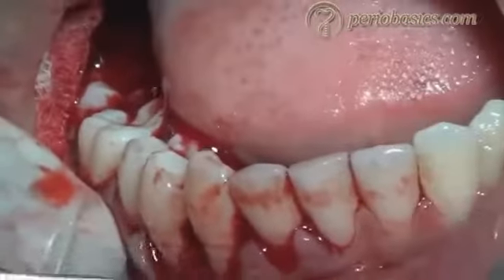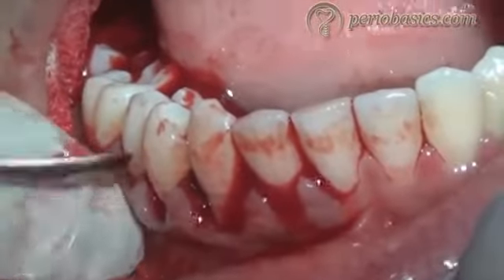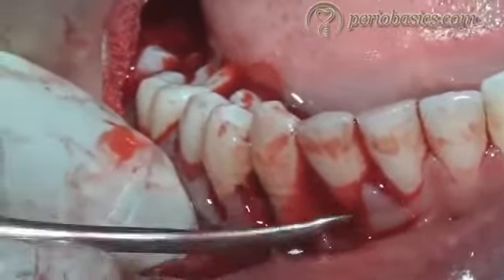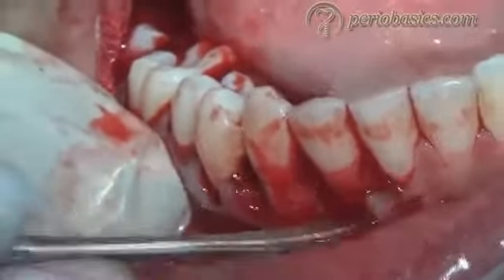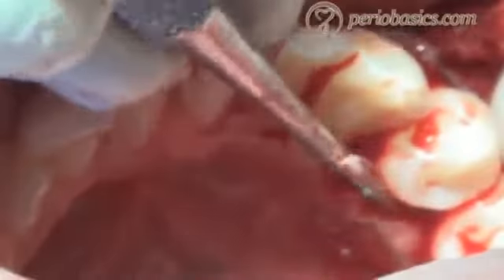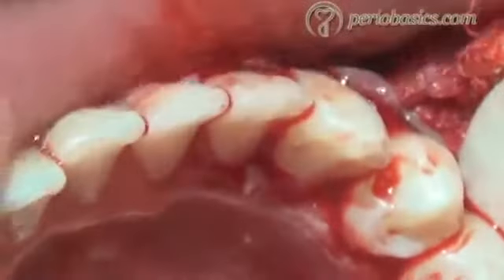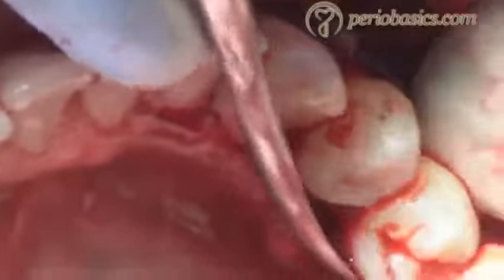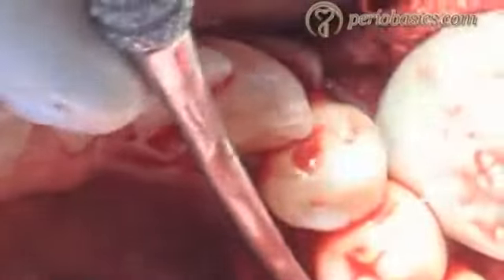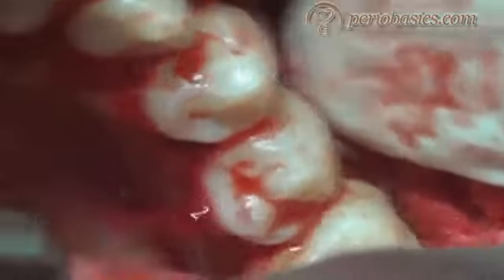and then we reflect the flap. So first of all we reflect the interdental papillae, and in the same way we reflect the flap on the lingual aspect. It is important to expose the marginal bone so that we can access the bone defects, but overexposure is not recommended.